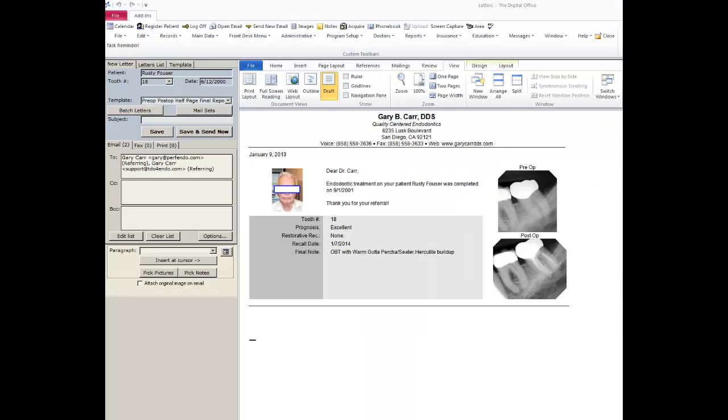It loads on the screen pulling in all the values from the patient's chart. This is the standard information from the final report page as well as the pre and post-op images are automatically loaded.